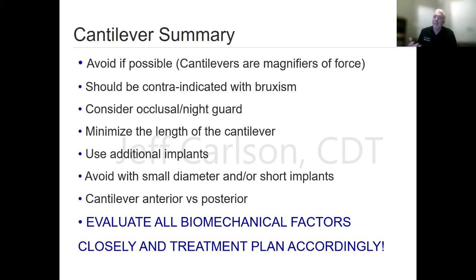Keep in mind, patients are going to expect these restorations regardless of what they're paying for it, whether it's $5,000, $8,000, $20,000 or $40,000, they're going to expect it to last a lifetime in 2 days. So design these accordingly, and keep their expectations in check with what they are agreeing to or willing to pay for, because they may want the stability of a fixed All-on-X, but they're paying you for a 2 implant overdenture.